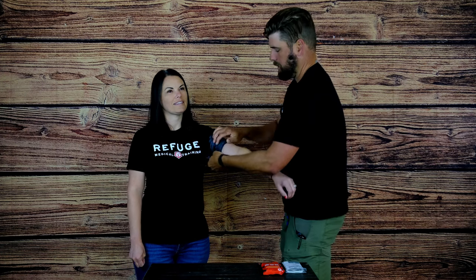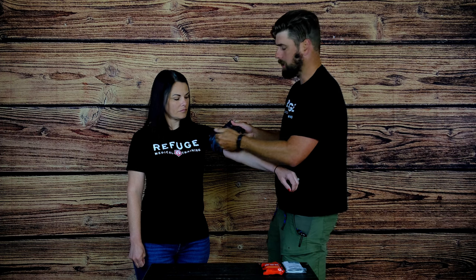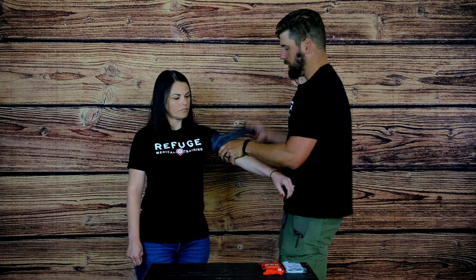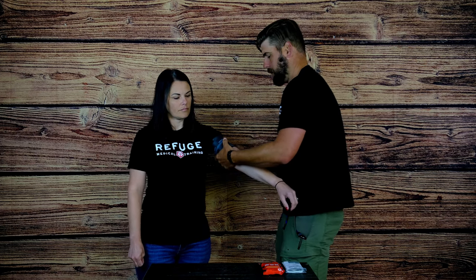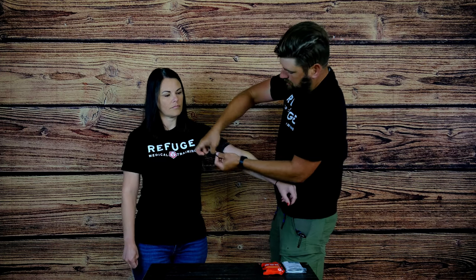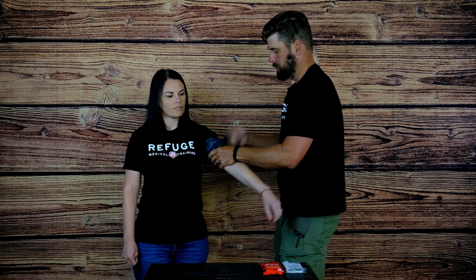One thing to keep in mind whenever you're putting this on — you want to keep it wider so you don't get any chance of nerve damage, which goes up whenever you go thin. So keep it nice and flat. Then when you get close to the end you're going to do the tuck part — just fish that on through. And there it is.